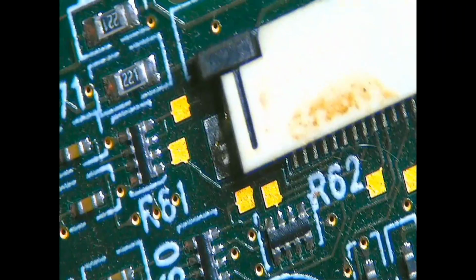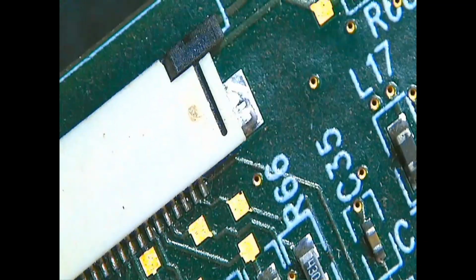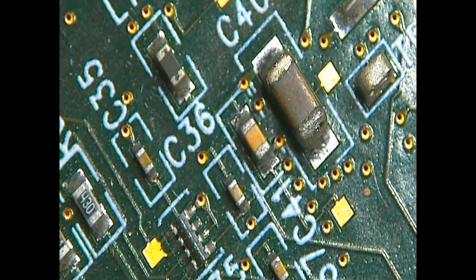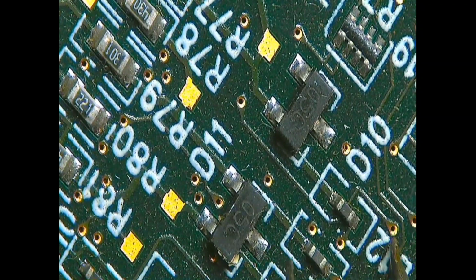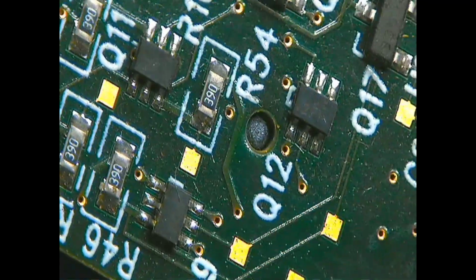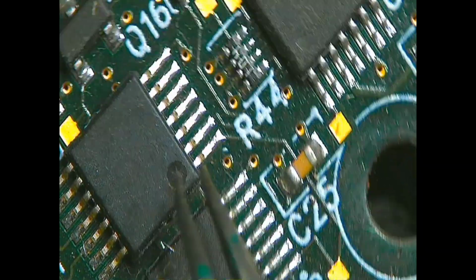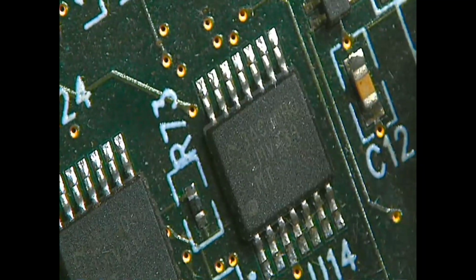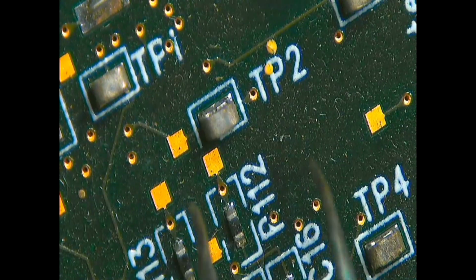So now we can check visually. I'm seeing if there are any burn marks or not. Clean. Okay. Sometimes components have corrosion, but in this board there is no corrosion, so we can go with physical examination, visual examination.